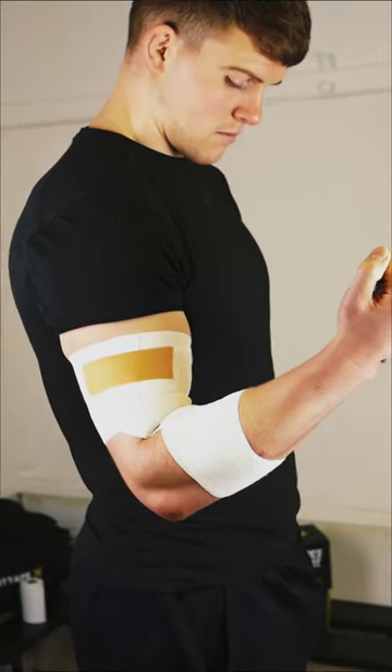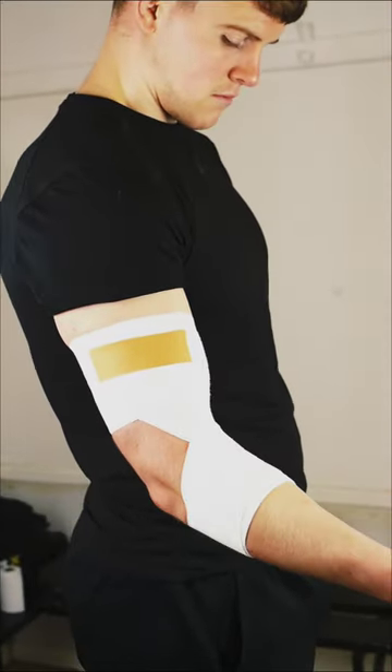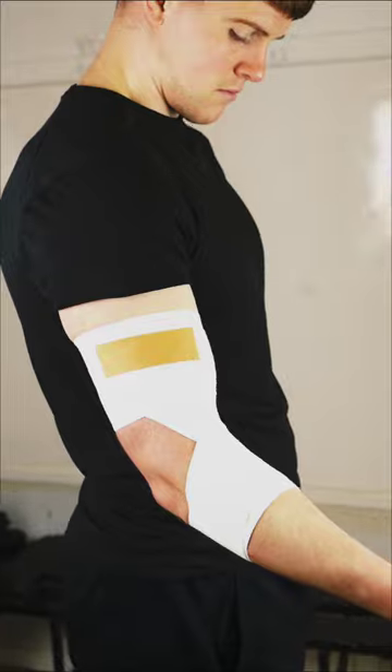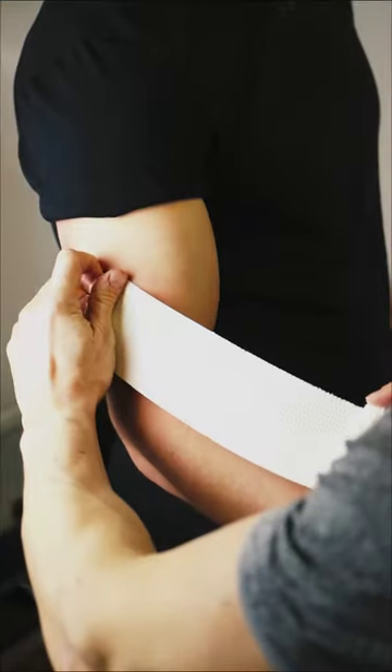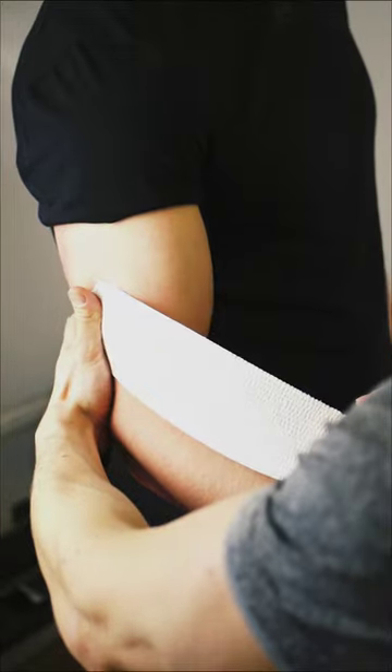Here's Cardiff Rugby Physio Ben Warburton's guide on how to strap an elbow for rugby in under 60 seconds using only two tapes: EAB and Zinc Oxide tape. The purpose of this application is to restrict hyperextension of the elbow by locking the elbow in a flexed position.